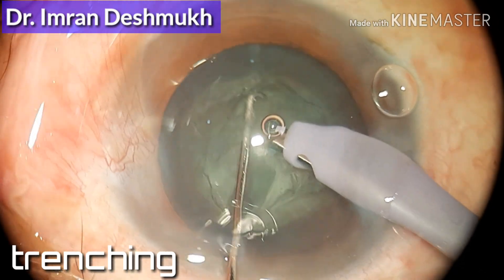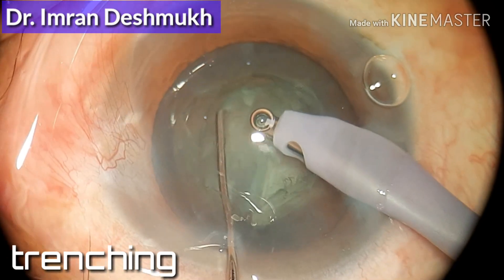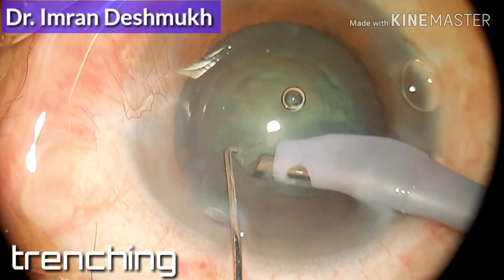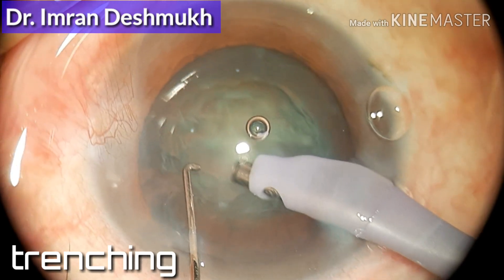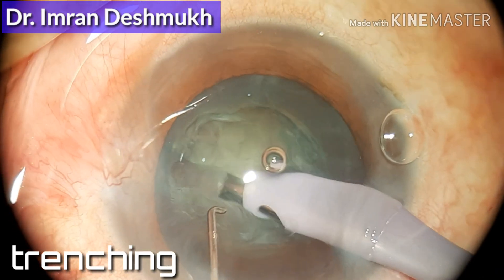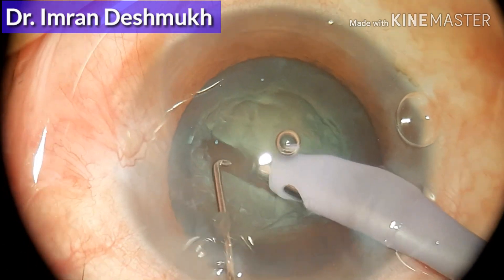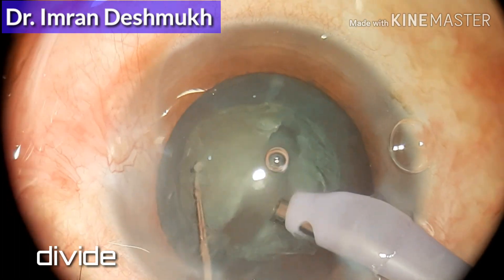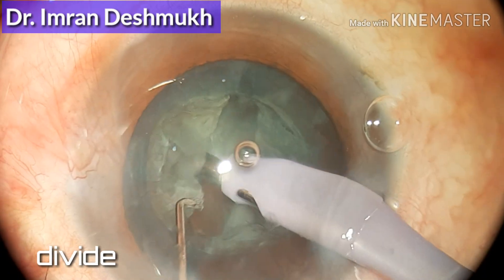I was a bit superficial, so I rotated the nucleus. After rotating the nucleus, I started trenching the other half — I've already trenched one half and now I'm going to trench the other half. Go a bit deep and start trenching; I could see the red glow now. Put both your instruments inside and move in an outward and upward direction so you can crack the nucleus.